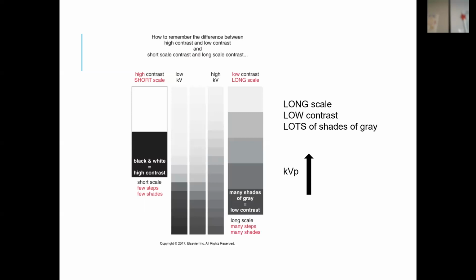I just picked those not because they ended exactly perfectly, but just to demonstrate how it'll come through and hit the sensor. It'll penetrate through all these layers of whatever this is better. And then you can make any other little notes around there that help you. But I'm going to show you this next one that kind of shows the same thing.